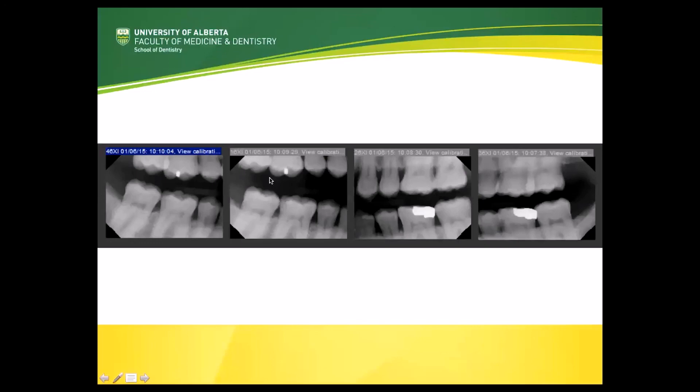Also, if you look on the premolar images, the distal of the canine and indeed lots of the first premolars, particularly on the bottom, are not visible at all. There's also a lot of overlapping of the molar contacts, both on the molar view and on the premolar views. So basically not great bitewings — let's explore what went wrong and how we could prevent these errors from happening.